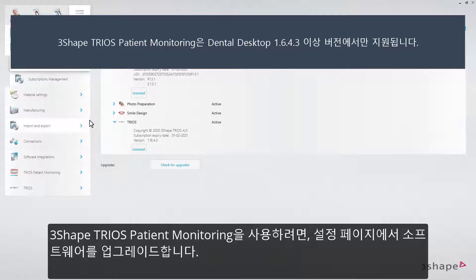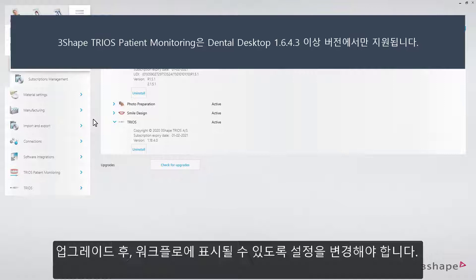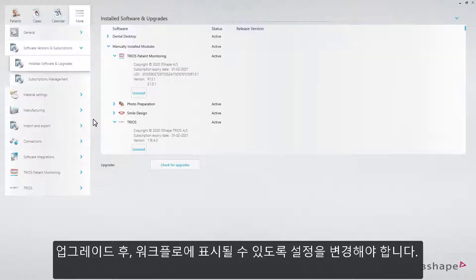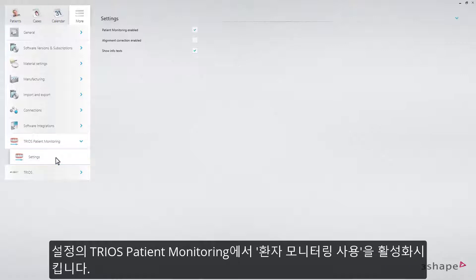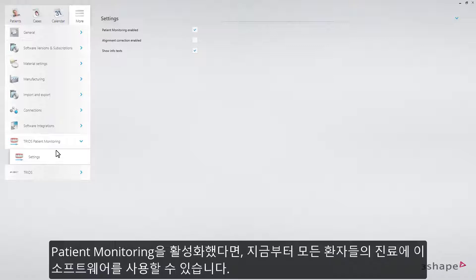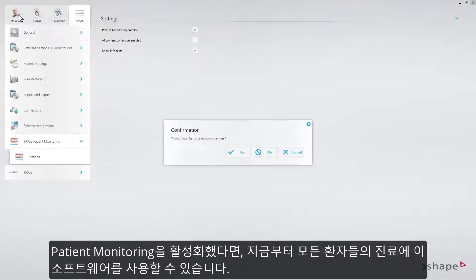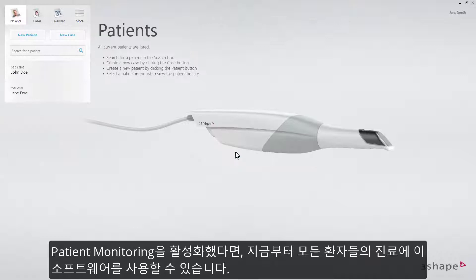To get Patient Monitoring, just press Upgrade in the Settings page. After upgrading, it must be enabled to appear in your workflow. Under TRIOS Patient Monitoring Settings, check the box to the right of Patient Monitoring Enabled. Enabling Patient Monitoring in Settings makes it part of your workflow for all patients.